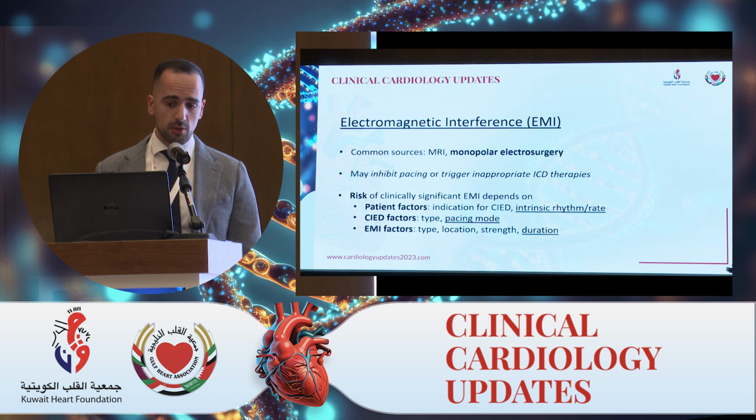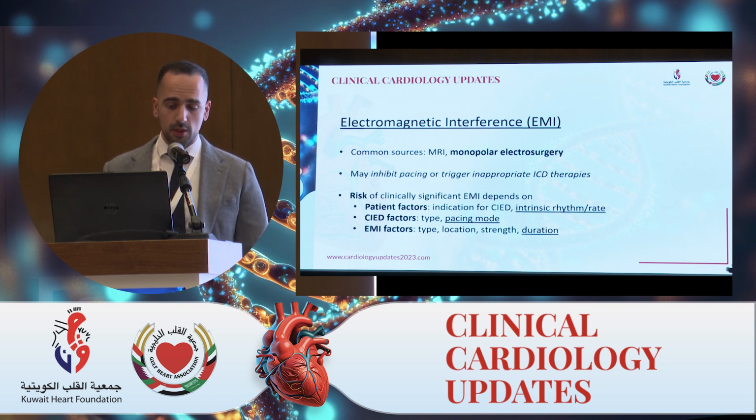This is the concern with MRIs as well as monopolar electrosurgery. The concern is, since these devices rely on electrical activity to function, if they pick up electricity from somewhere else, it won't know. All it knows is it's seeing electricity. So electromagnetic interference in a pacemaker could inhibit pacing, and in a defibrillator could trigger inappropriate therapies.